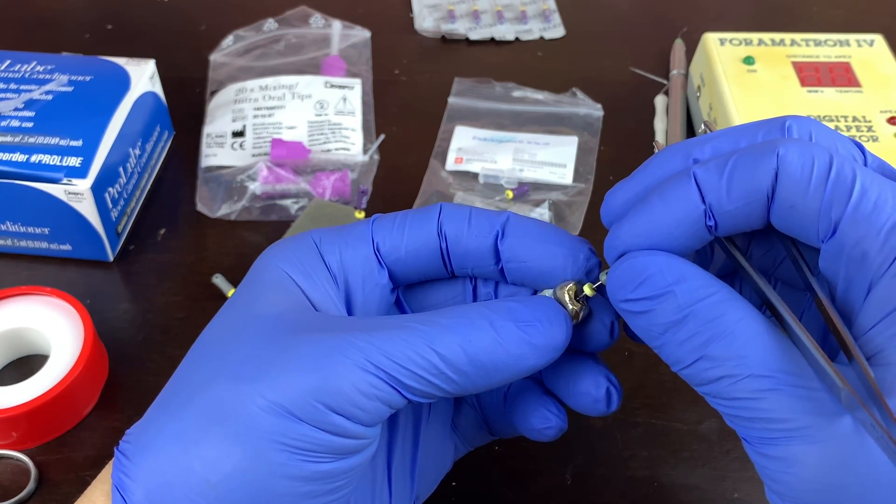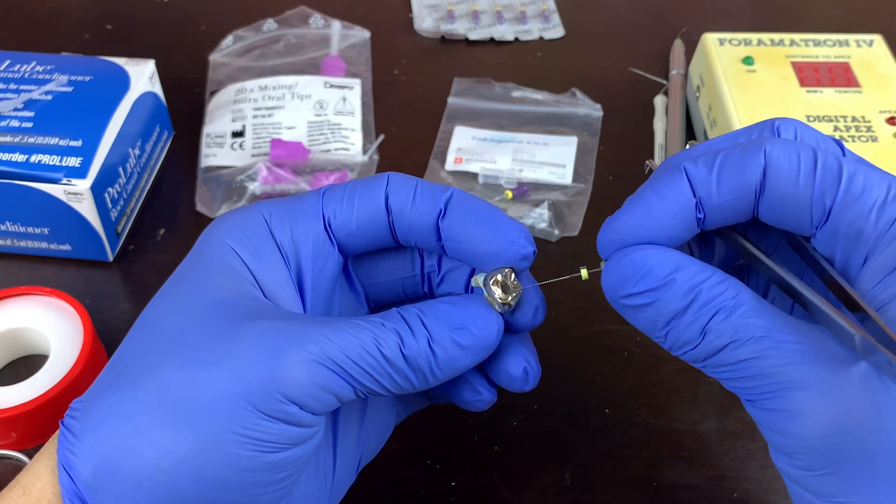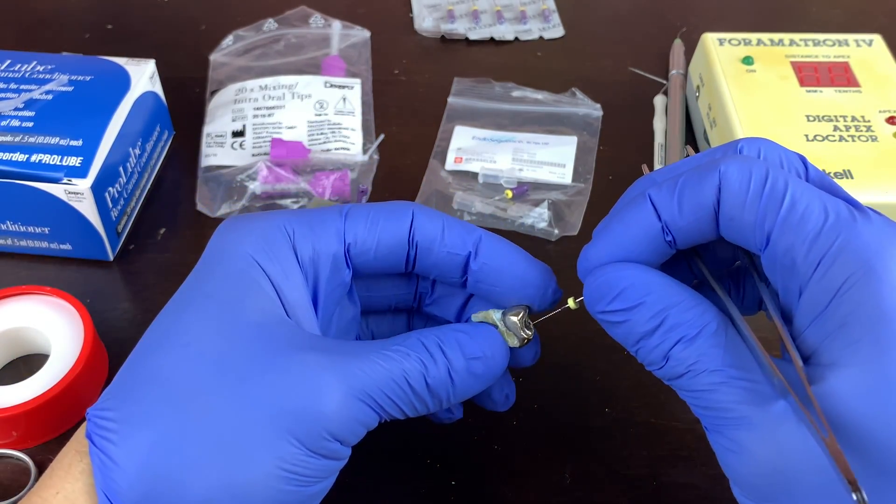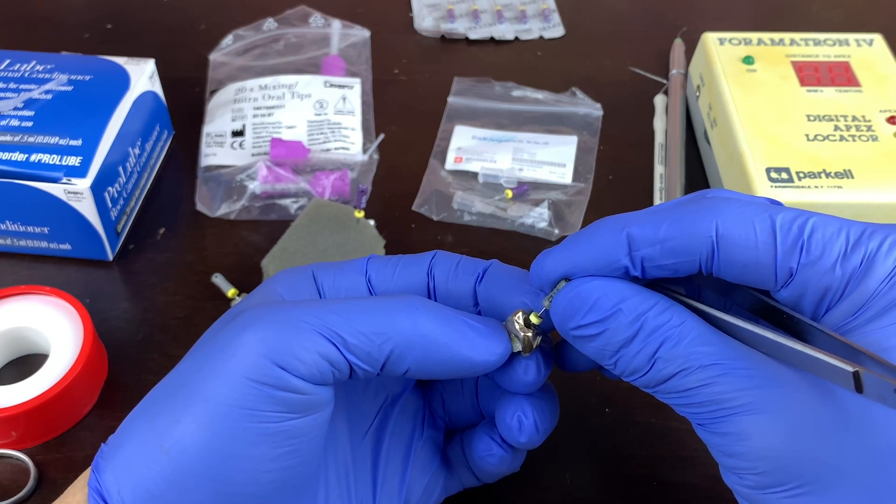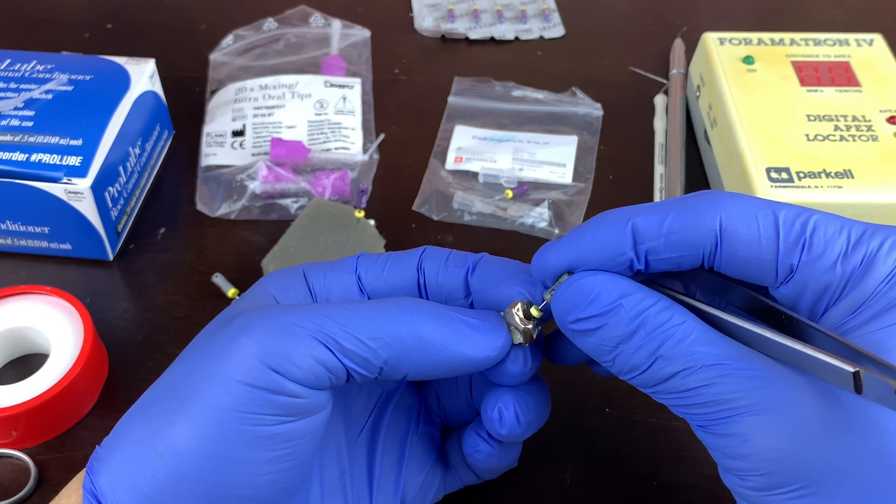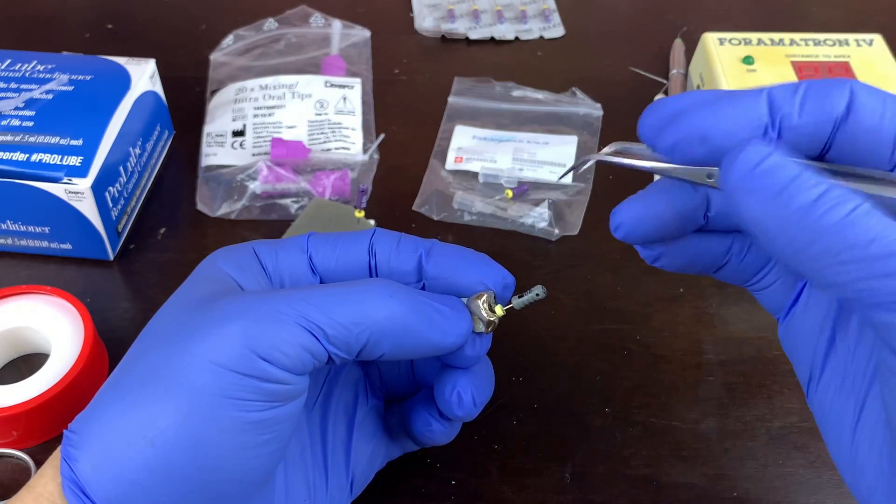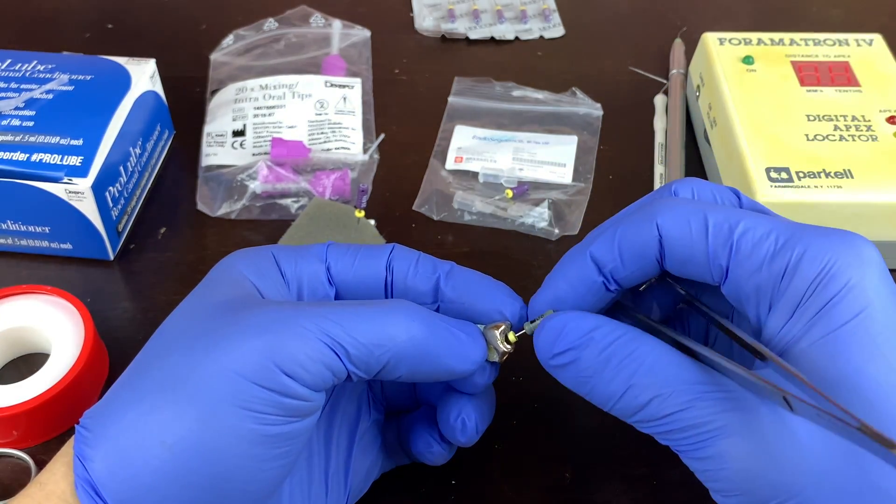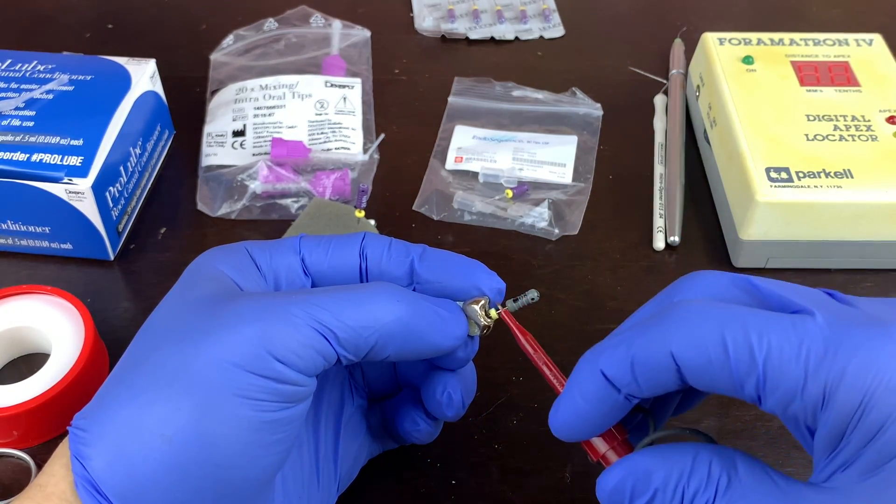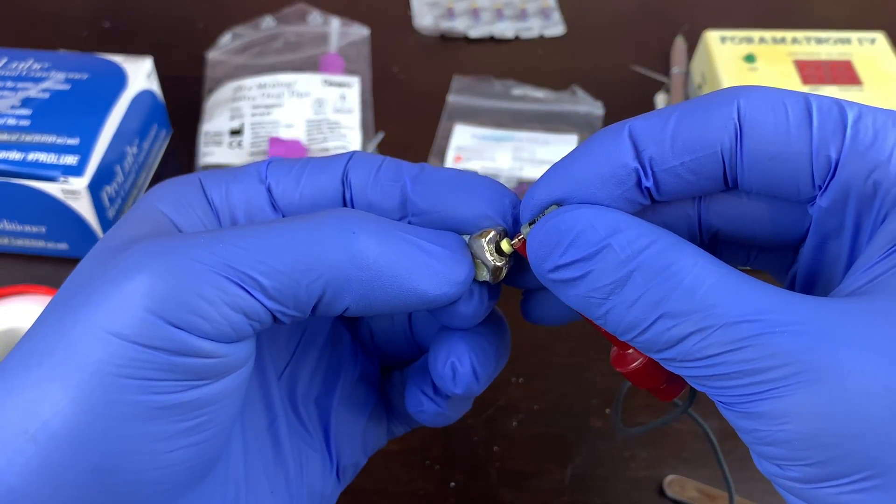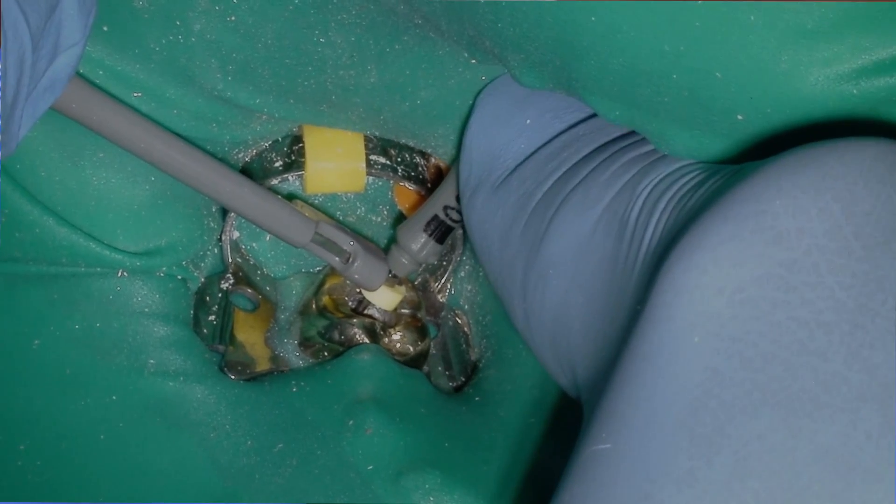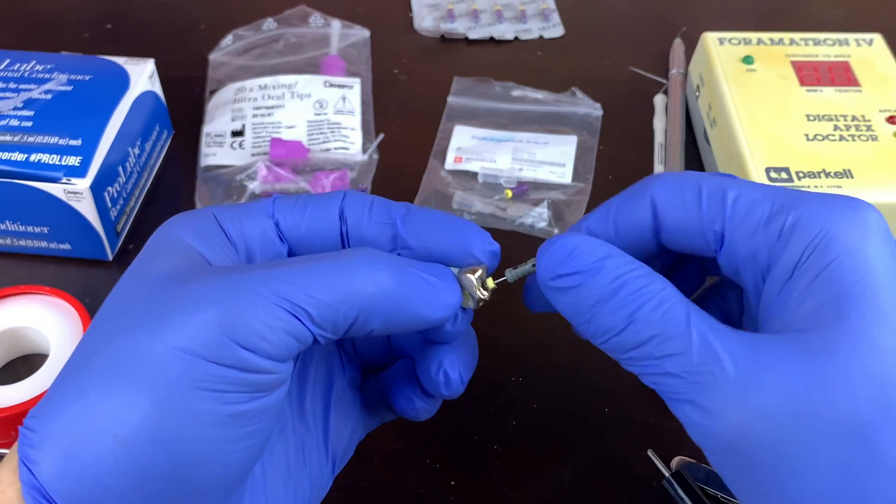Because we all know we get that crazy sporadic measurement when we touch metal, a gold crown, or a large restoration. Now, the second technique is a little more difficult, is just kind of keep the file centered. And then once you get your length, it doesn't matter if it touches. Place your file there. So you get your working length with your apex locator. Place your file and place your apex locator clip on there. Keep the file centered as close as possible. And then once you are happy with your length, then you can pull it over to your reference point and then measure from there.